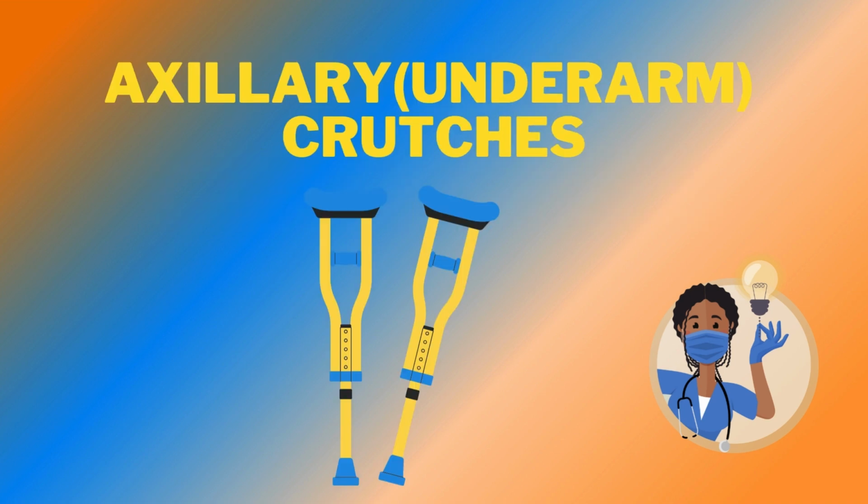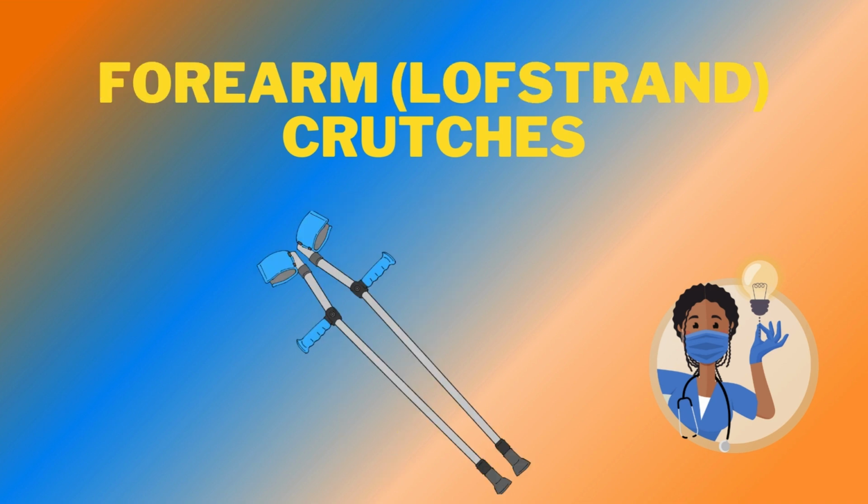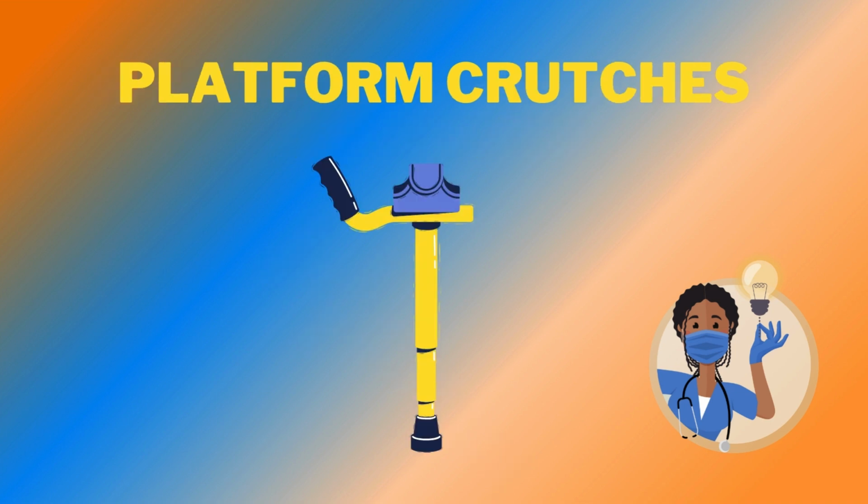Axillary, underarm, crutches, most commonly used, especially for short-term injuries. Forearm, Lofstrand, crutches, provide more support for long-term use and for patients with permanent disabilities. Platform crutches, used when patients cannot bear weight on their hands or wrists.